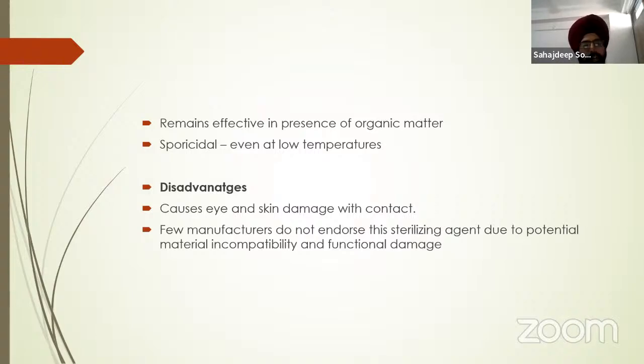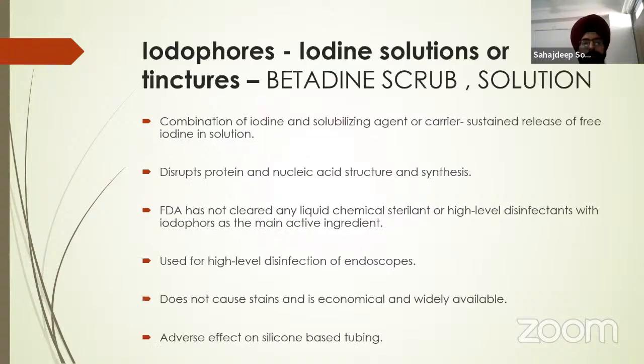It is sporocidal even at low temperature. Disadvantage again is it causes eye and skin damage with contact. And few manufacturers do not endorse this sterilizing agent due to potential material incompatibility.